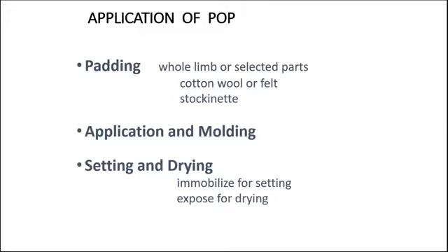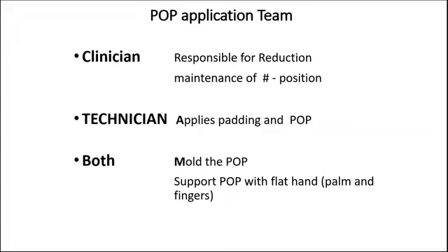This process is a factor of time. So it takes time to pad, it takes time to apply appropriately and mold. And of course, you need to give some moments for setting and drying before you release the patient.